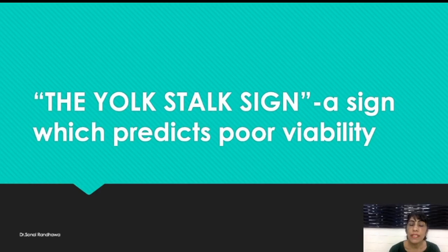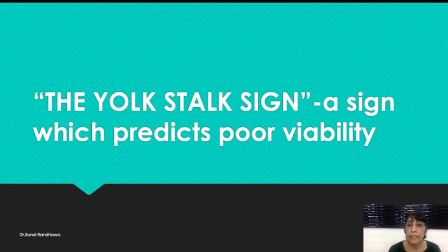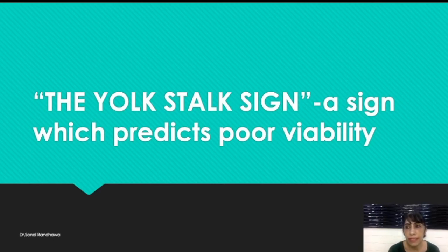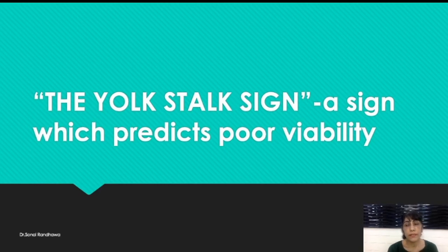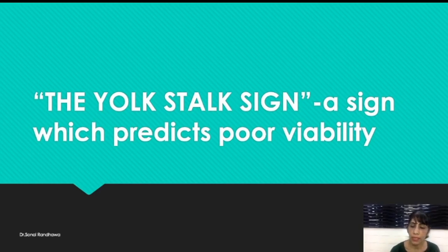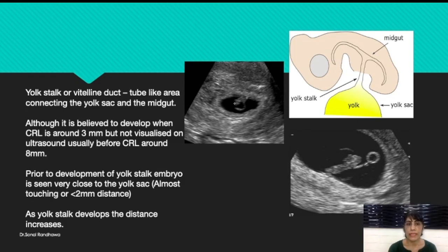Now this is one sign which can further add to your confidence when you are doing a viability scan. Suppose you are not able to see the cardiac pulsations at a CRL of around 5 mm or more — you can make use of this sign to know that viability is likely to be very poor. I would not say that once you see this sign you can 100% say there will be poor viability, but this is a very strong indicator that this fetus will not show cardiac pulsations in the future scan and has already gone into missed abortion.